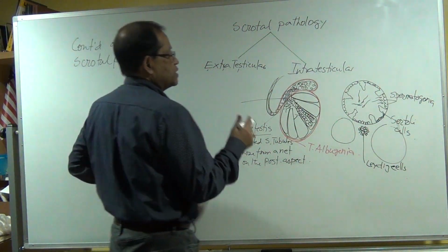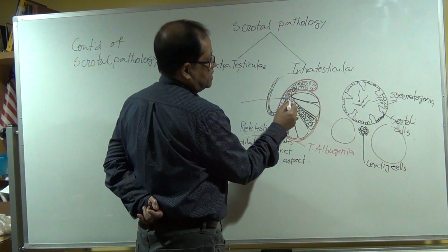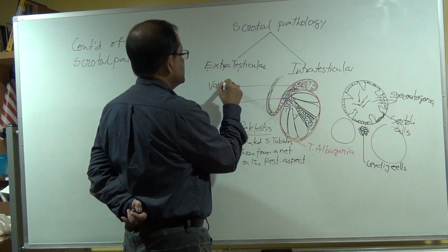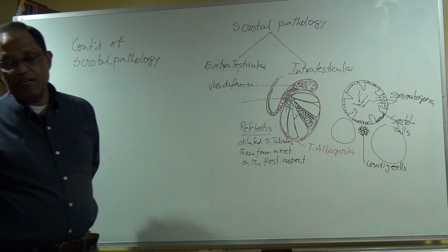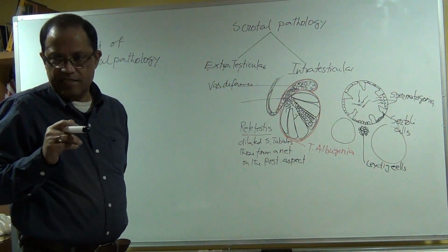Okay? So now look here. These tubules make the vas deferens. So this is the vas deferens.